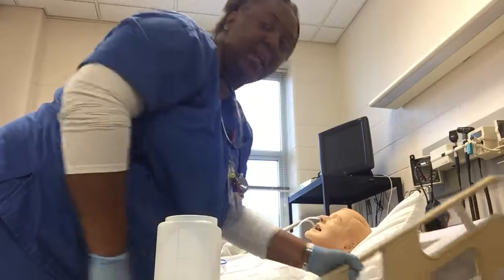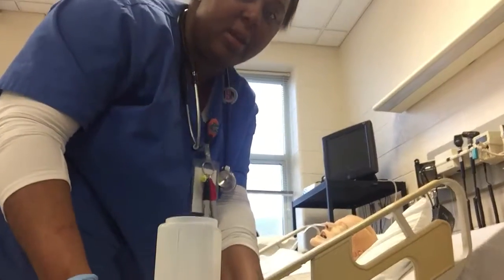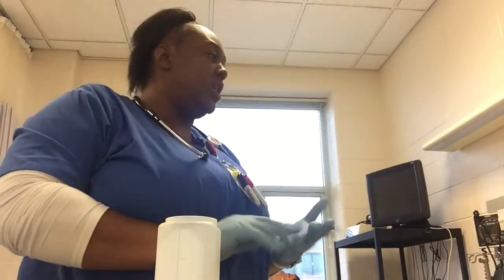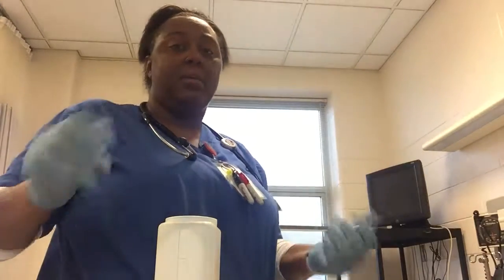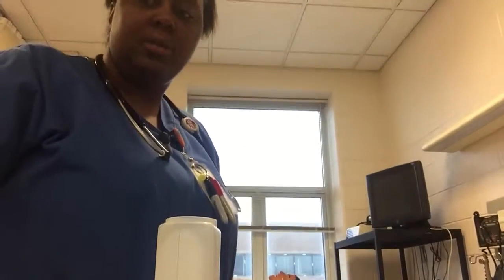And then I'll keep the patient at least at a 30-degree angle to ensure that they are not going to aspirate on anything. And once that is done, I give them that call light, clean up all of my mess, wash my hands, and then I will document the procedure. And that concludes the NG tube lavage and gavage.